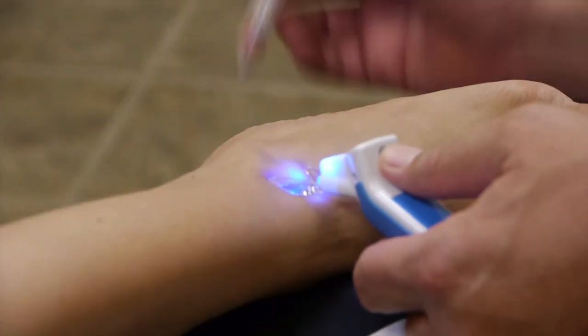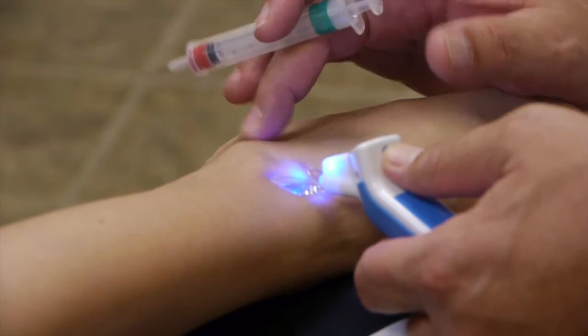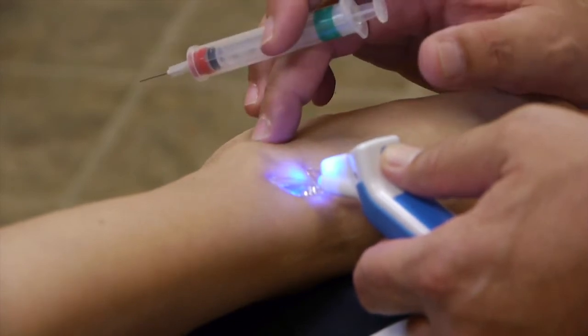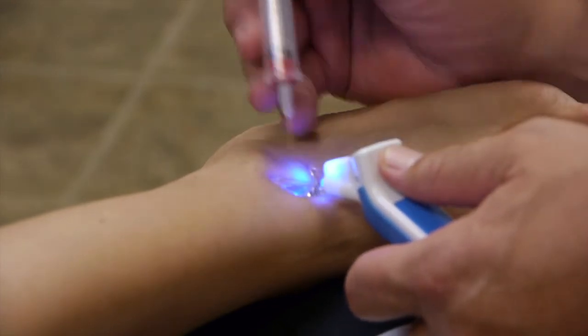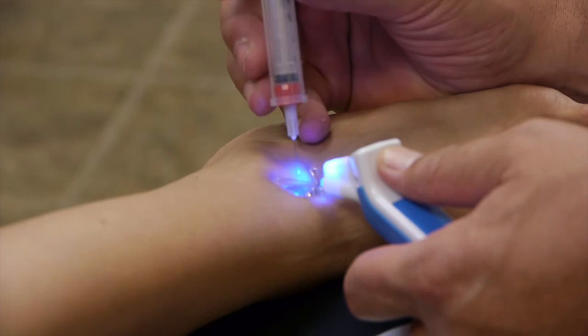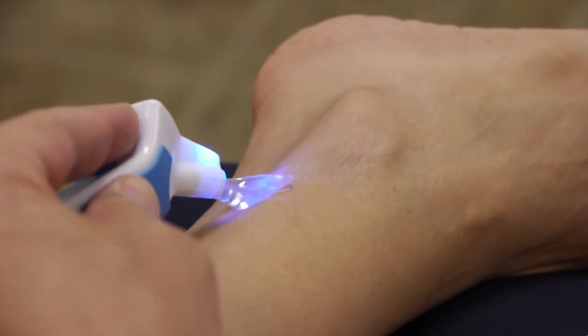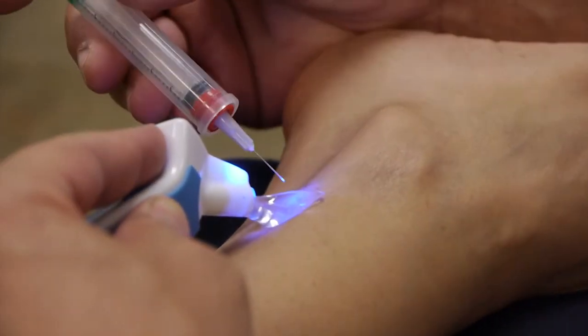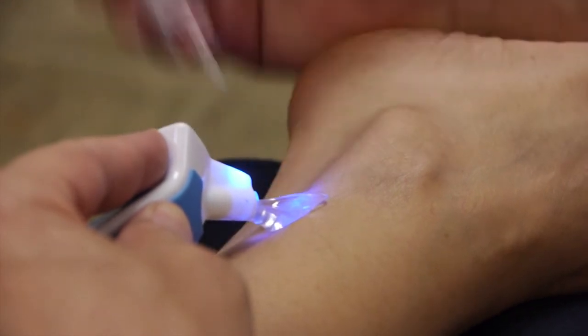Going into the lateral aspect of the ankle joint, I know that the joint is 1.5 centimeters proximal from the distal aspect of the fibula. So I'm right at the level of the ankle joint, and I put the device on, and then I would inject right here, right at that point. For the peroneal complex, if I were to inject in this area, I put the device directly on the peroneal complex, and then I can inject right where the beam is at that point, right there, just holding it like that.